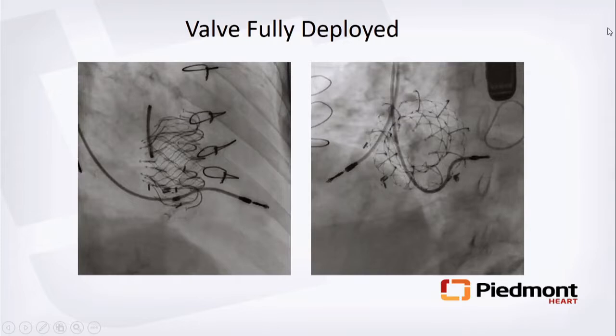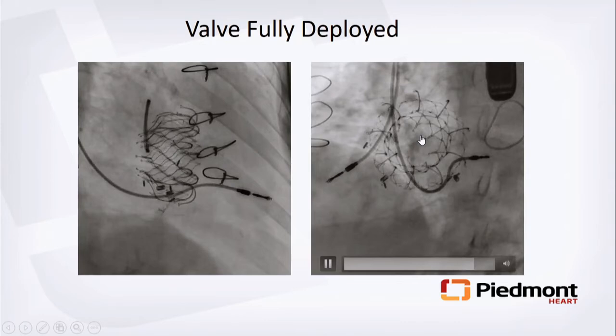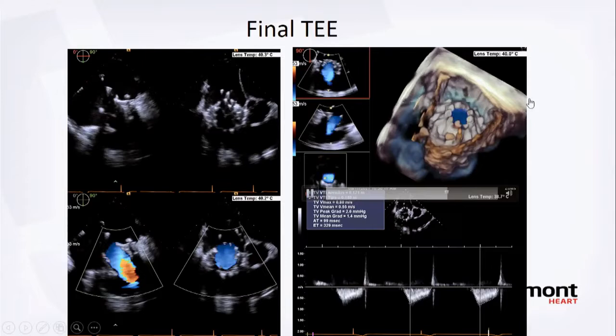The valve is fully deployed: short axis and long axis views show the outer frame at the 44/48/52mm dimension. The inner valve is actually a 28.5mm bovine pericardium. Final TEE shows complete resolution of tricuspid regurgitation — just a mild trace of TR near the pacemaker lead.